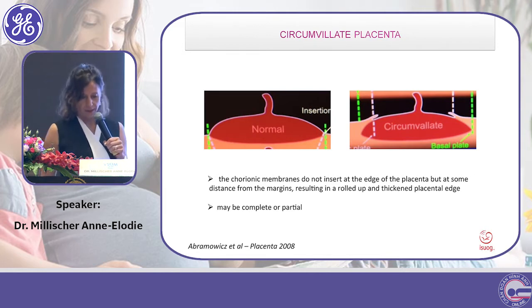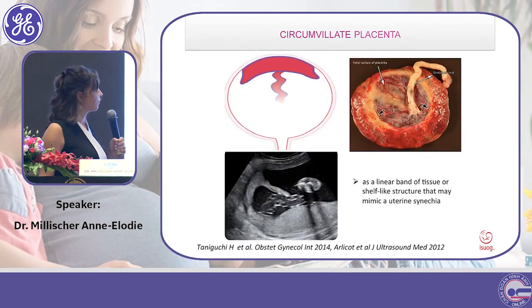Cái đặc điểm của cái hình dạng này nó khác với một cái bánh nhau bình thường. Cái bánh nhau bình thường mình có cái màng đệm nó bao tới cái mép của bánh nhau luôn. Còn trong cái bánh nhau này thì cái màng đệm với cái màng ối nó không bao, mà nó sẽ gấp nếp lại, nó gồ lên ở cái rìa của cái bánh nhau.